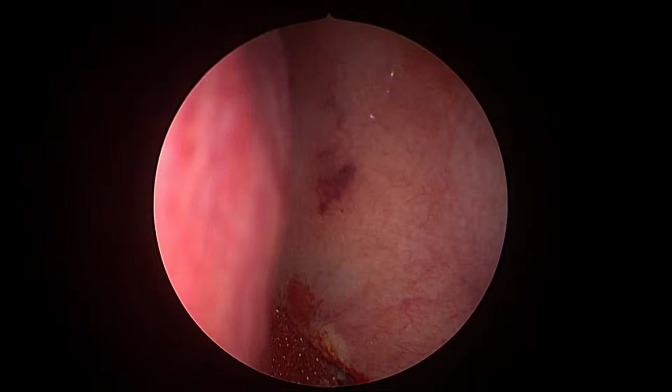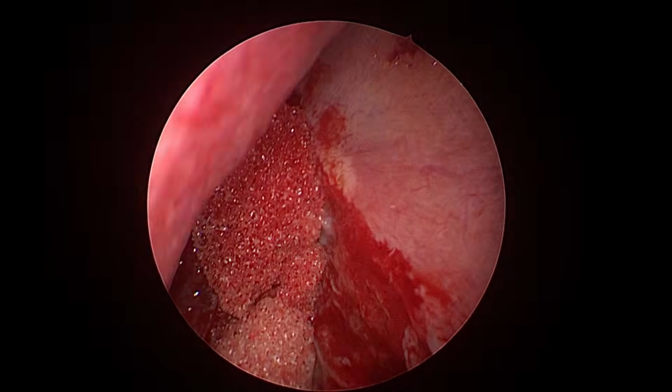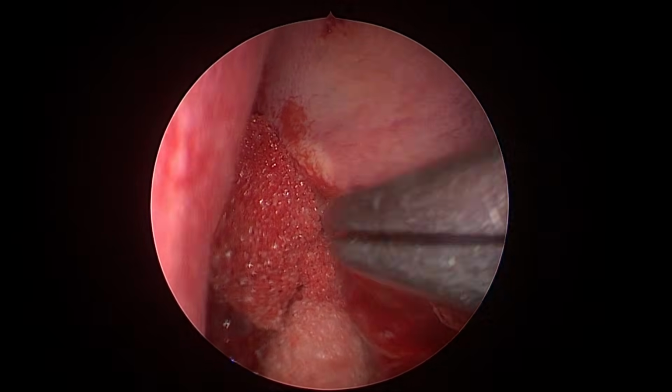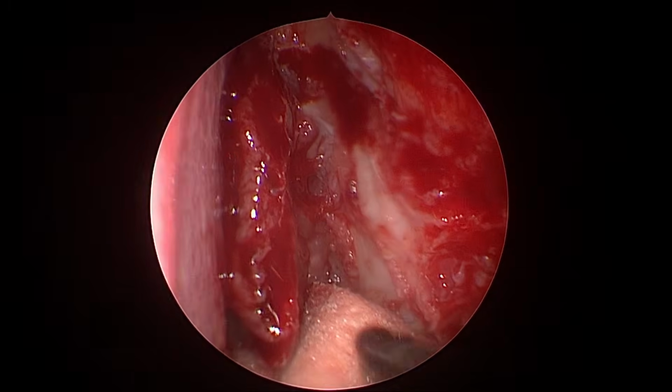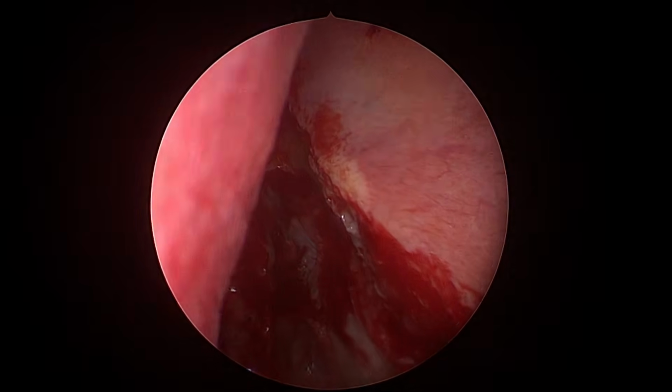What is this? Oh, this is a laryngoscope, man. This is laryngoscope, not sinoscope. It is a laryngoscope. Yes, it is upside down. Anyway, this is laryngoscope, boss. Lens should face upward. Now see what we have got.